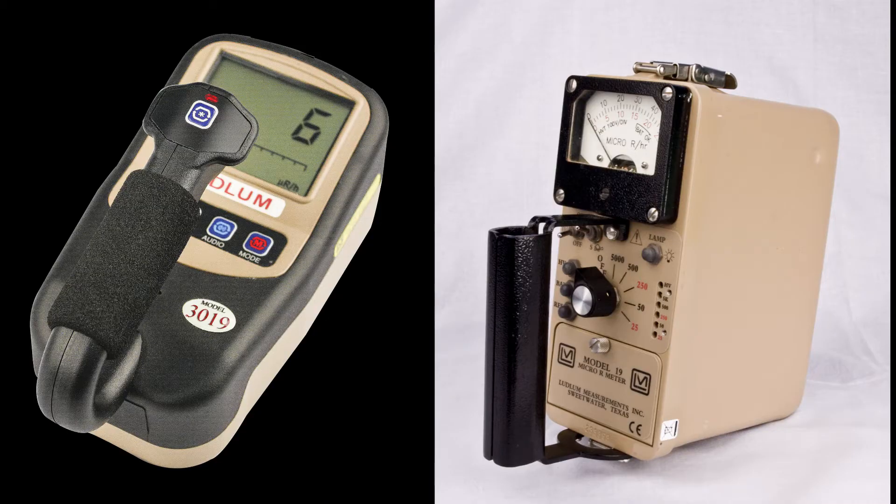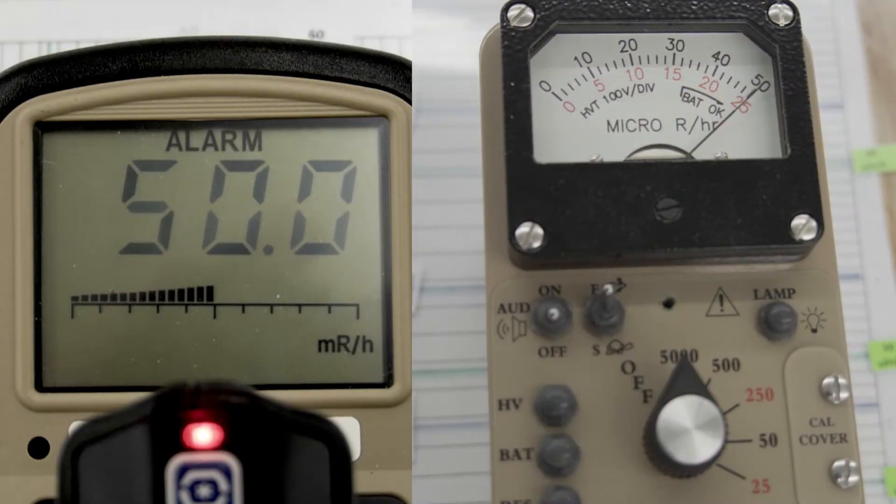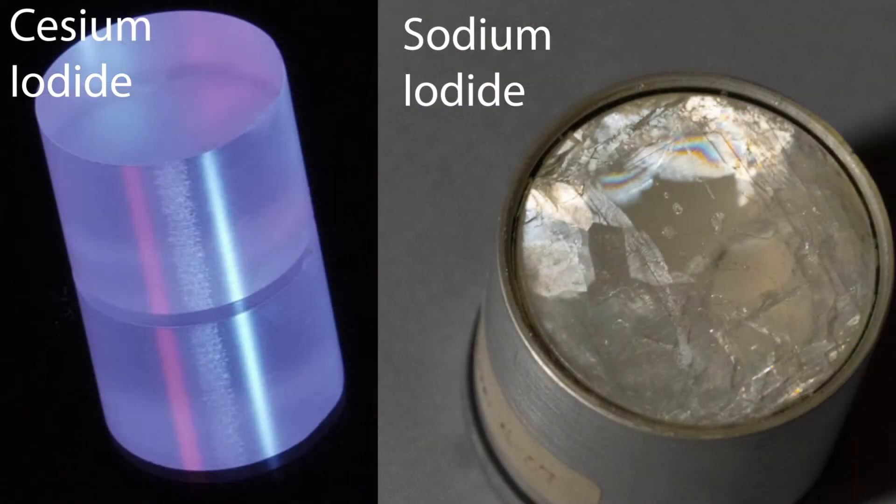The 3019 has many advantages over the older Model 19. One advantage is that it can measure up to 50 milliR per hour, where the Model 19 can only go to 5 milliR per hour. Also, the crystal inside the instrument is made of cesium iodide, which is virtually unbreakable compared to the sodium iodide used in the Model 19.